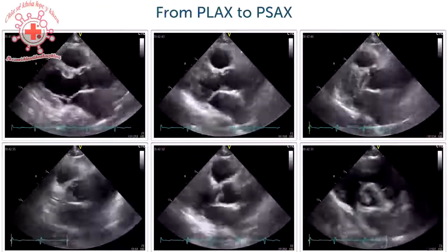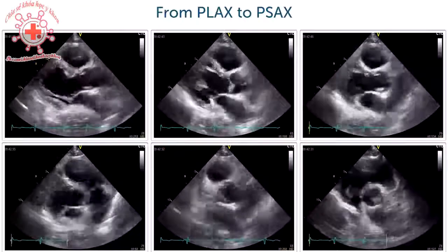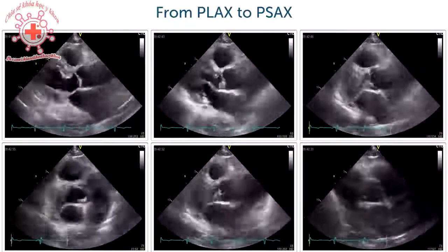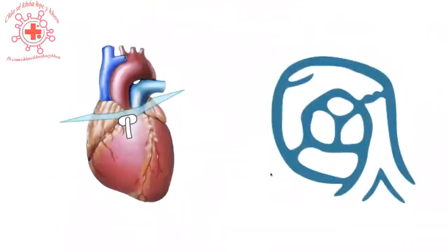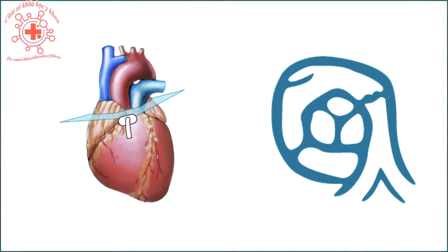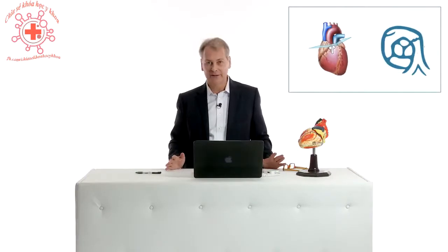Be aware that you also have to keep the position stable — in other words, the angulation should not change; it should always be the same. Also try to always have the left atrium in your field of view. If you look at the classical graphics of a parasternal short axis view, it is always displayed such that you have the aortic valve and the pulmonic valve nicely visible at the same time. In reality this is not always the case — usually you either have to focus more on the aortic valve or on the pulmonic valve.